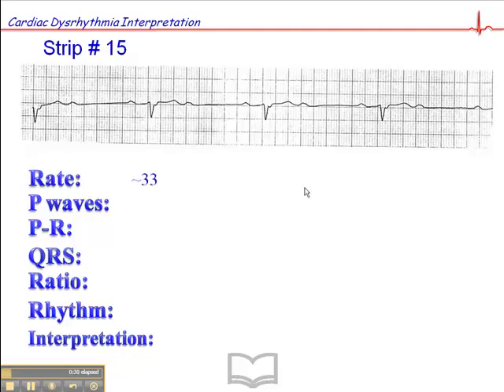So the heart rate is about 33 and let's measure it out here. This QRS falls pretty close to the dark line, so that's 300, 150, 100, 75, 60, 50, 43, 37, 33. This falls just on this side of the dark line, so does this one.